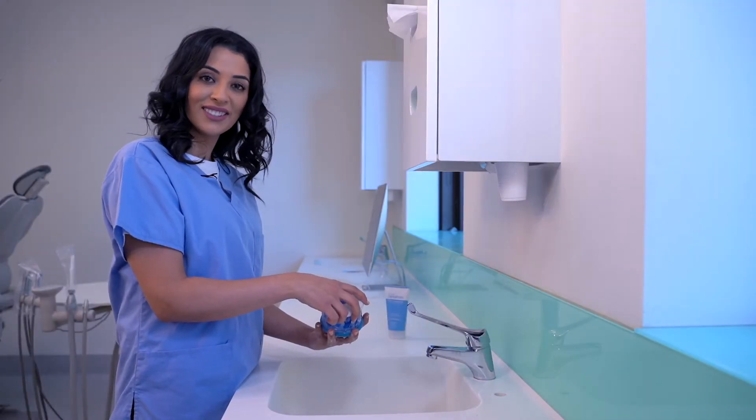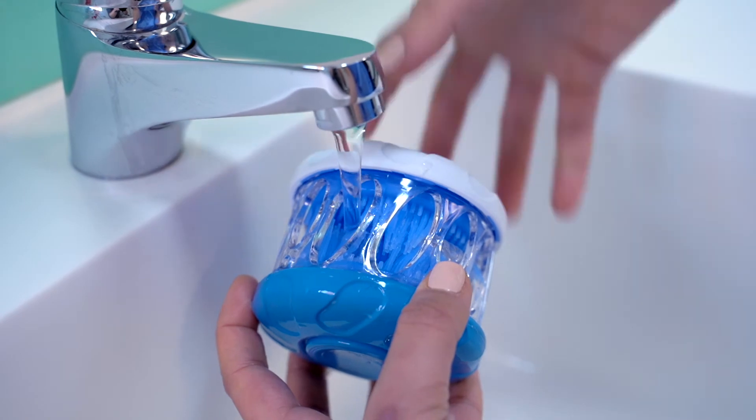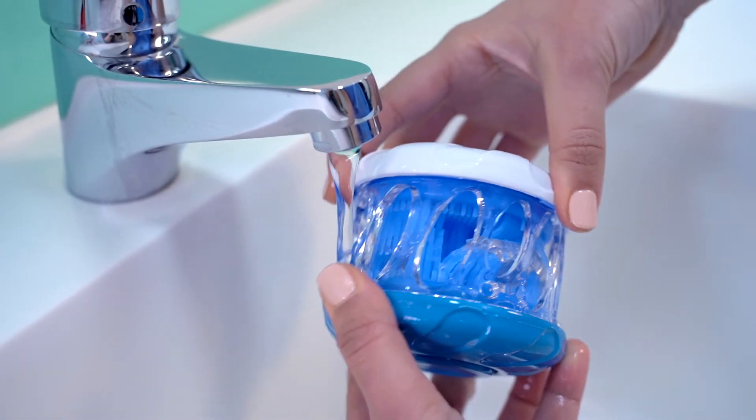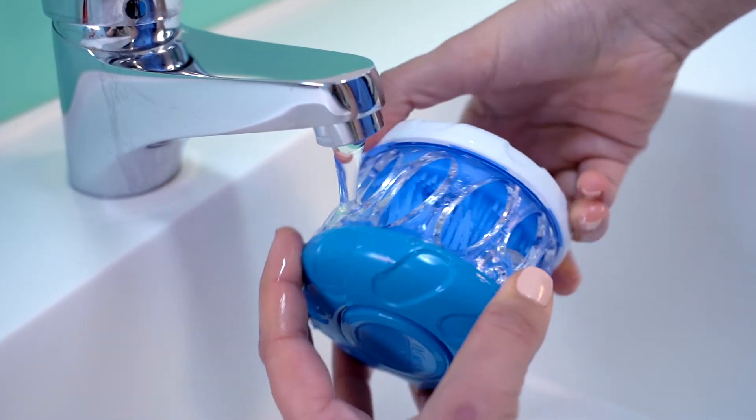Now let's rinse. Under a gentle flow of water, use the multi wash action until all Dental Fresh foam is thoroughly rinsed away and clear water runs through your Hygiene.